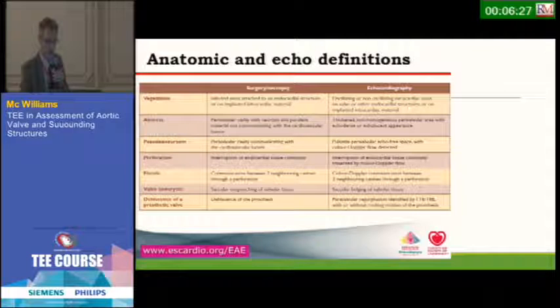And we mentioned fistula. Fistula is a communication between two neighboring cavities, and this is what we see on echo, but also we're looking for other complications of endocarditis, like an abscess, a pseudoaneurysm, a valve aneurysm, a dehiscence of a prosthetic valve. I showed you a dehiscence of a valve earlier. It wasn't in the context of endocarditis.